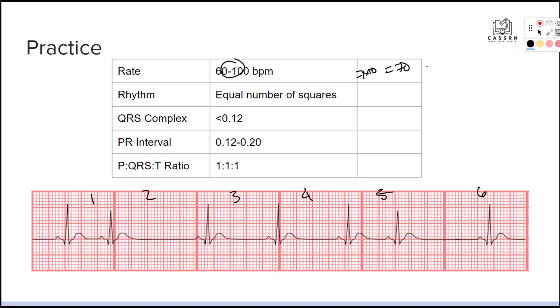Then we want to check our rhythm to see if it is regular or irregular. We're going to look at the intervals between beats that don't include our PACs. Counting the small squares between normal beats gives us 22, and counting the next interval gives us approximately 22 as well — close enough. So we're going to say the underlying rhythm is regular.